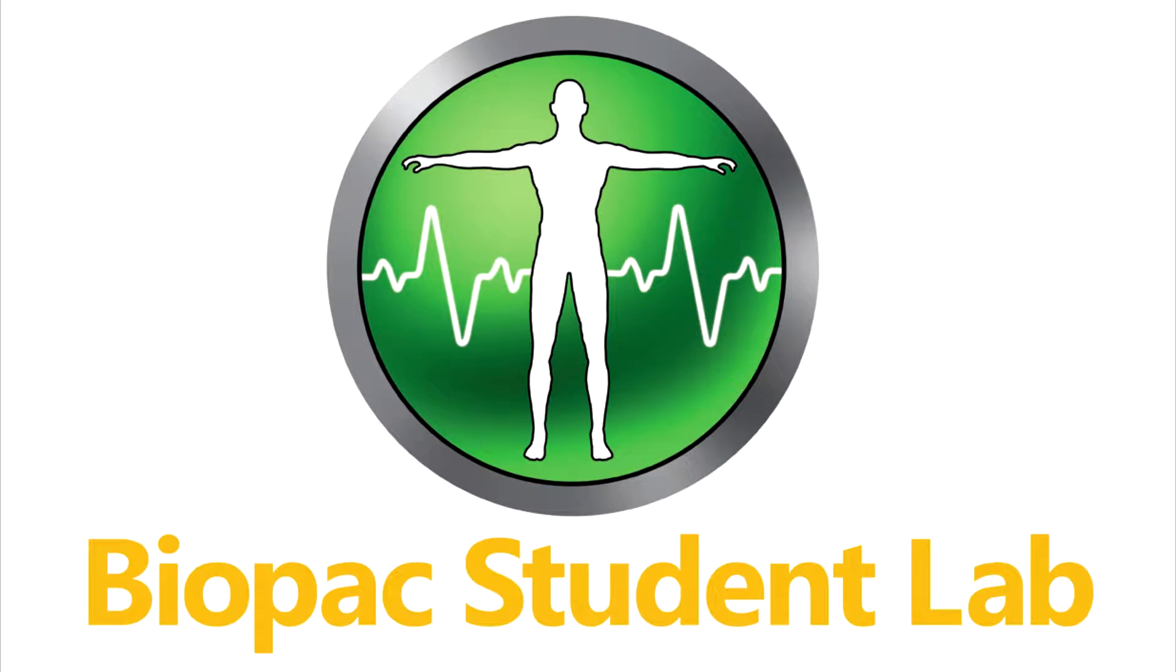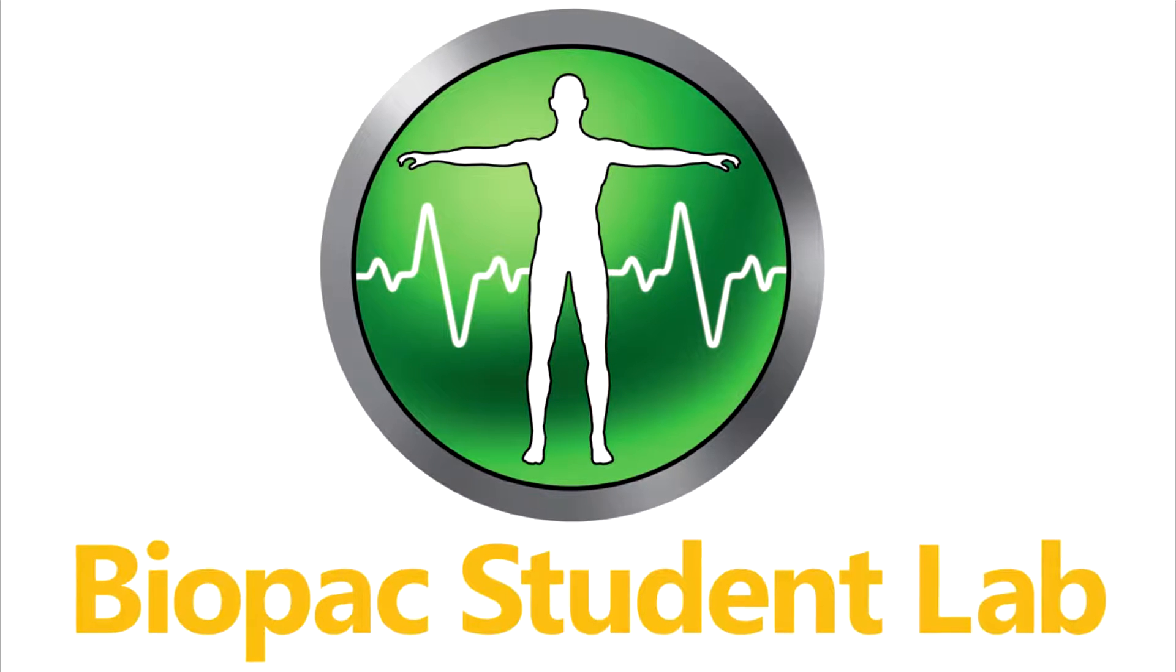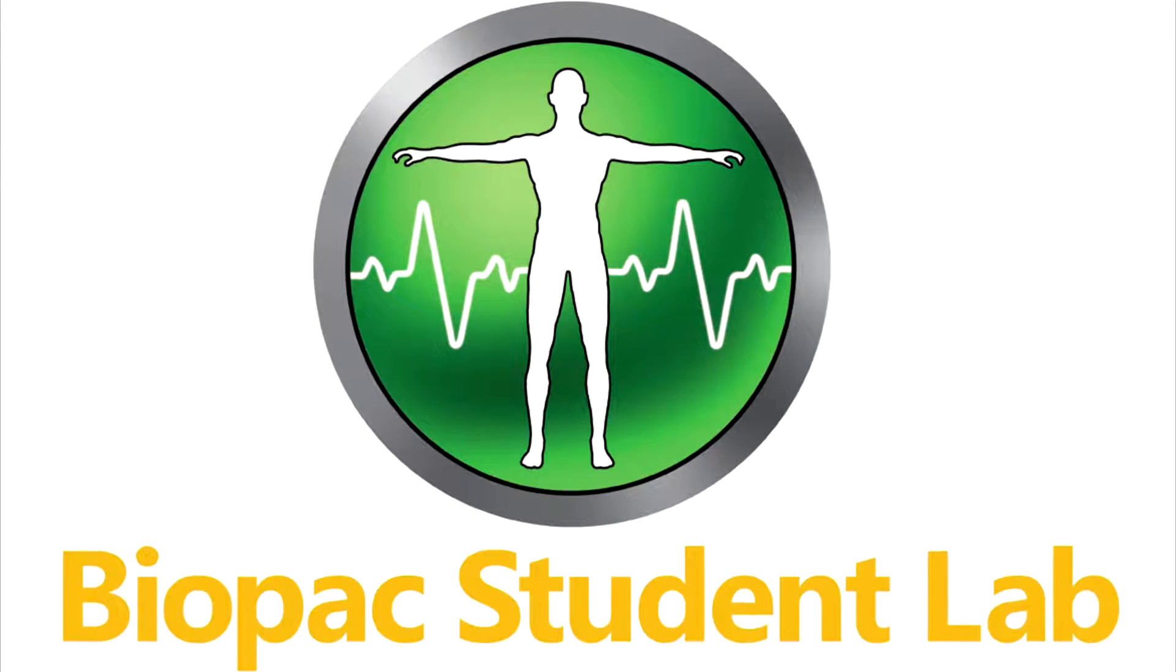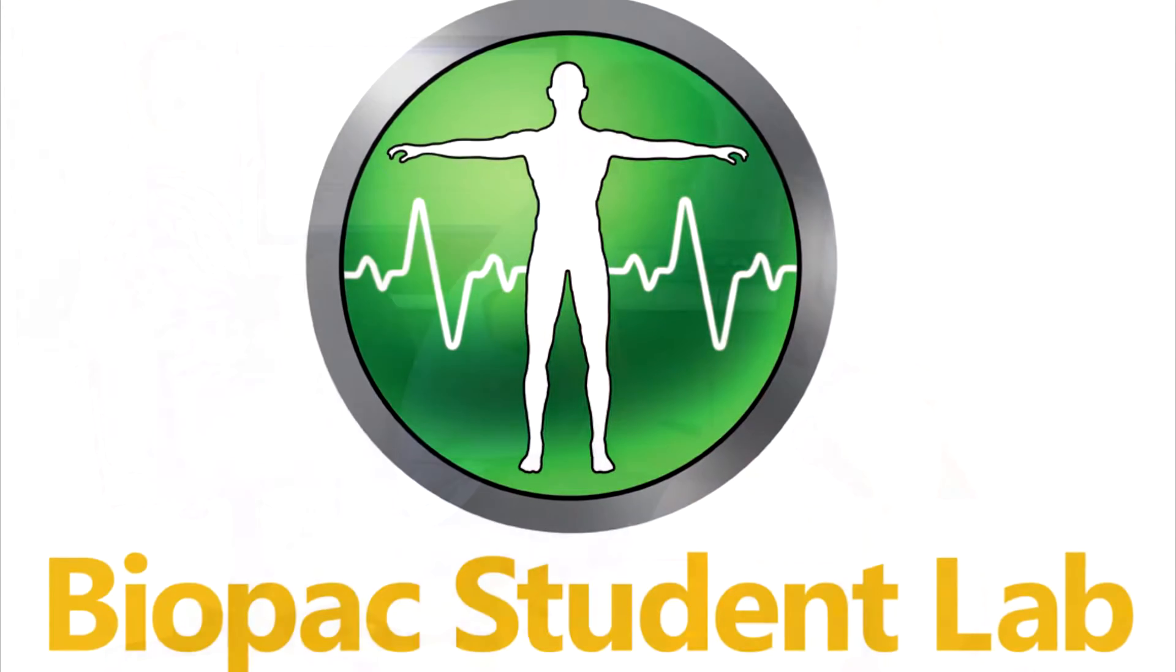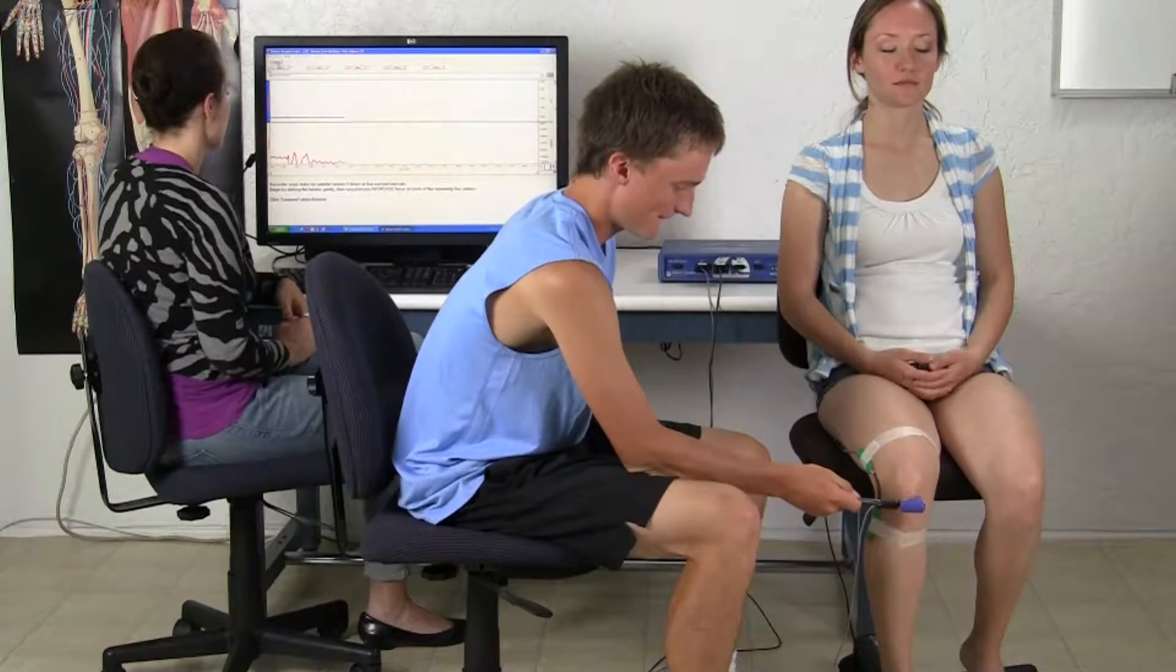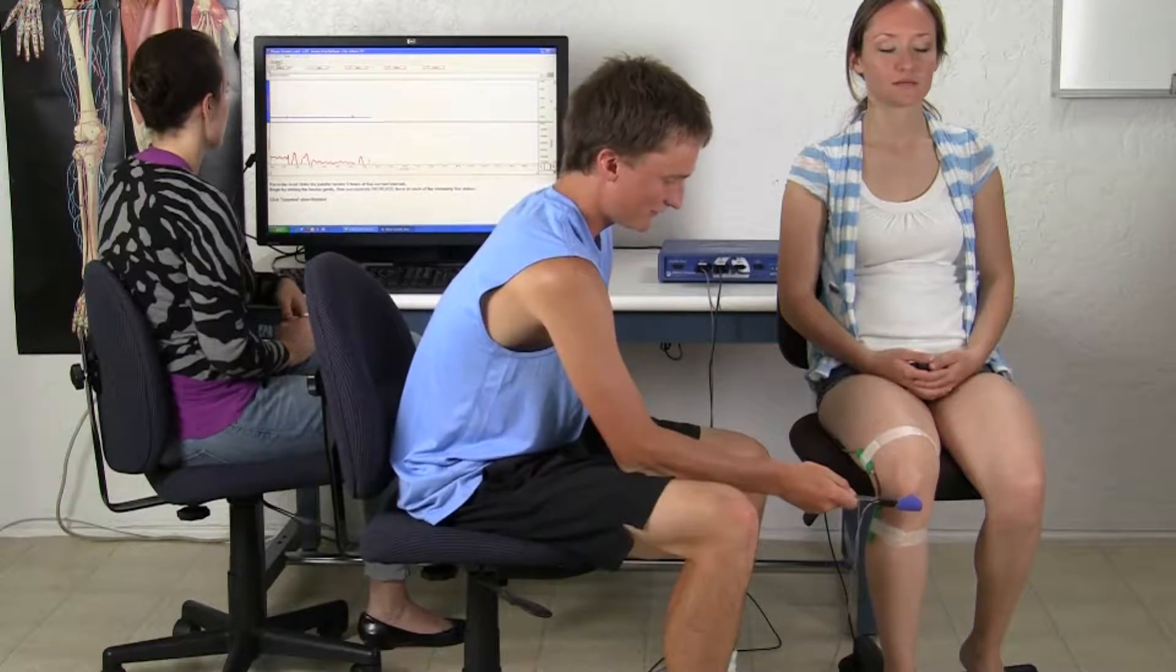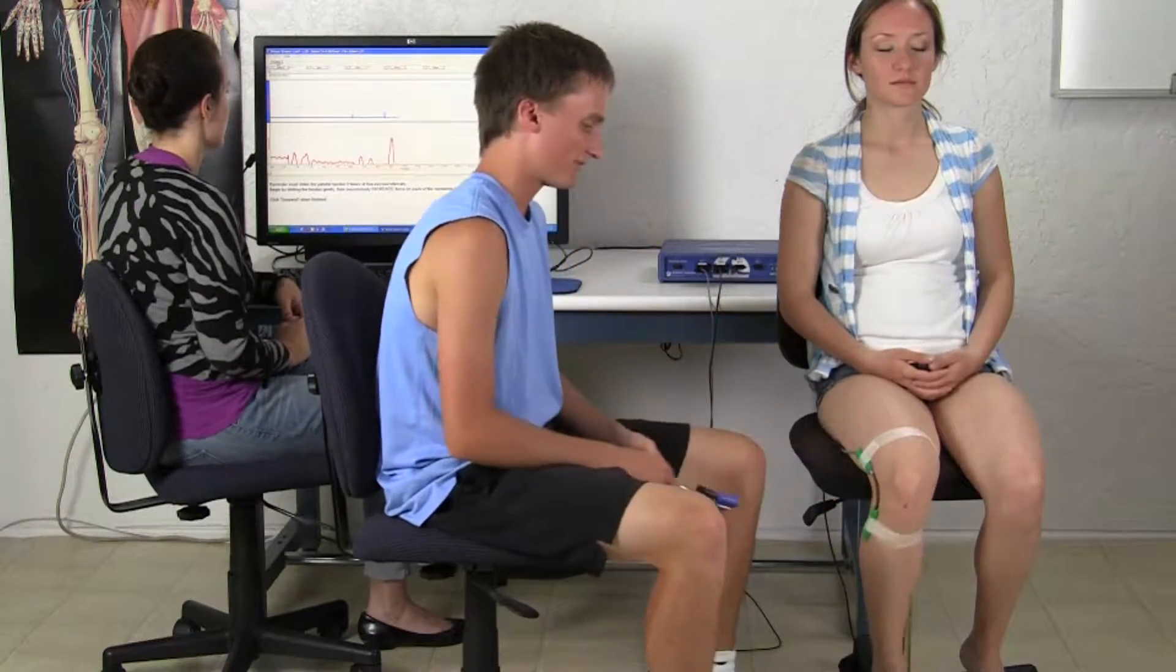The Biopac Student Lab is an integrated system of hardware, software, and curriculum used by thousands of labs worldwide at two-year, four-year, nursing and medical schools for undergraduate and graduate life science studies.